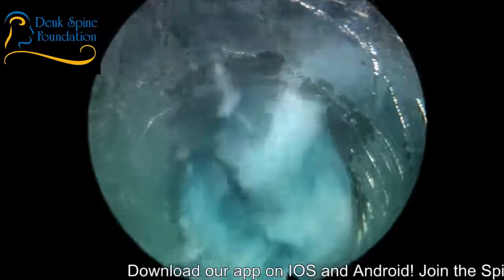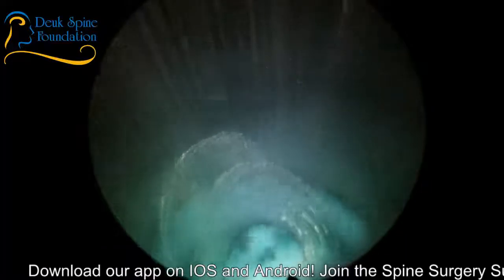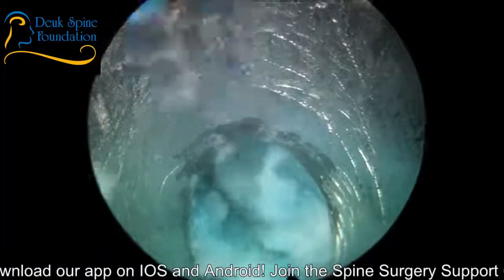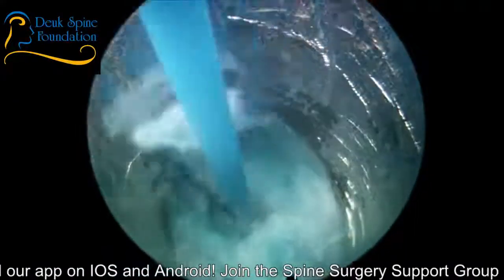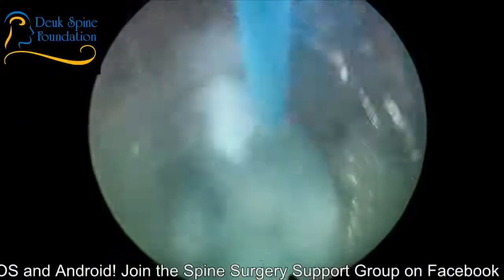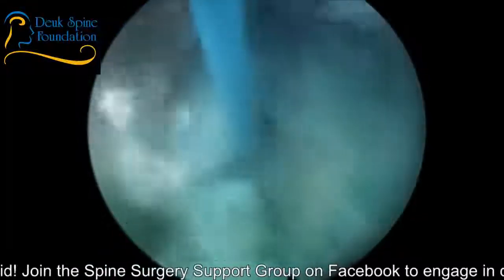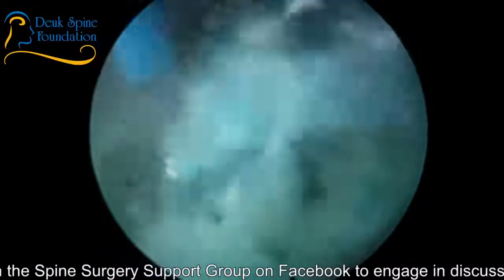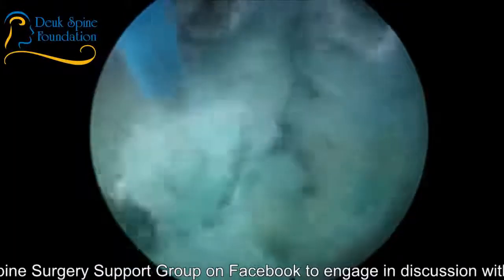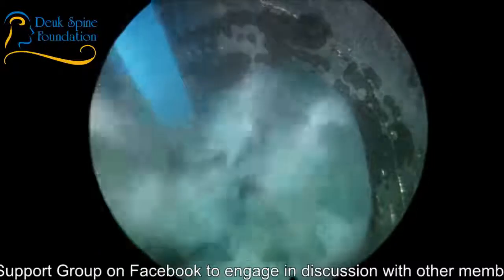Okay. Let's get started with the laser. So good observation, yes, indeed. The large tears will leak the dye out very quickly. You won't get much pressurization. You may not be able to elicit a response.